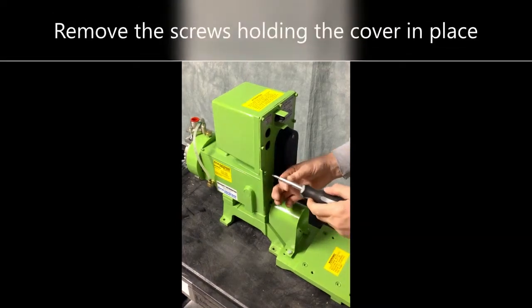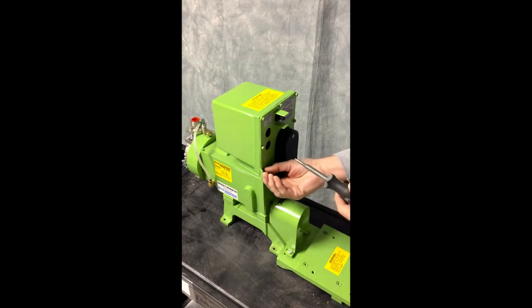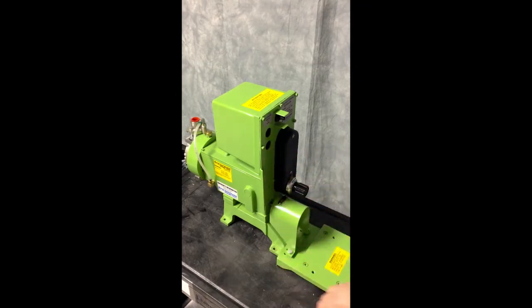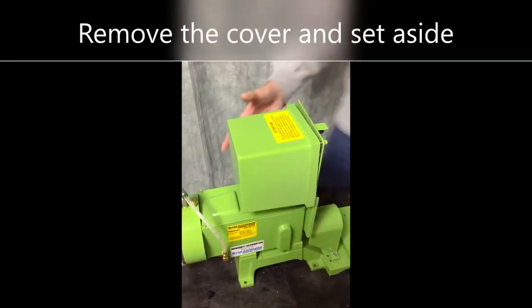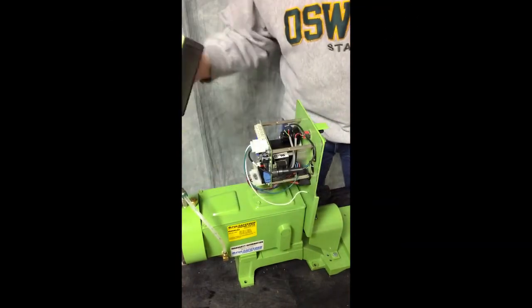The first step will be to remove the seven screws holding the cover plate on the ELMA. With all of the screws removed, you can now gain access to the internals of the ELMA.